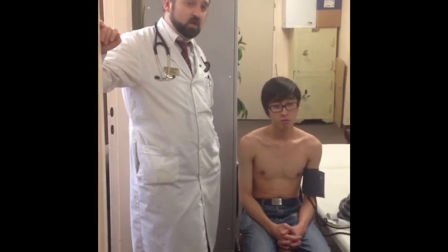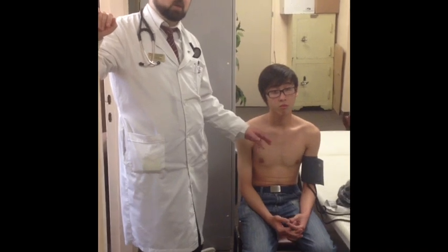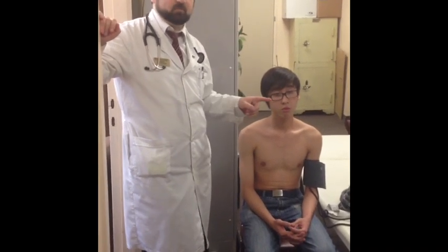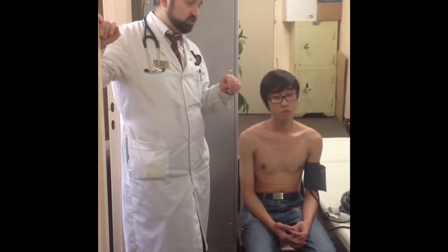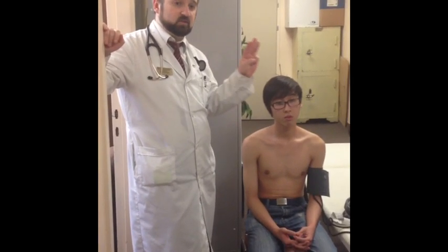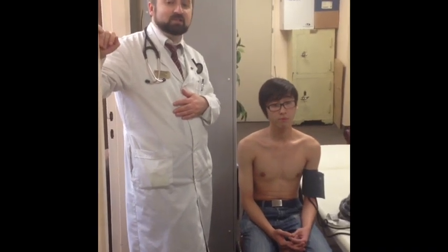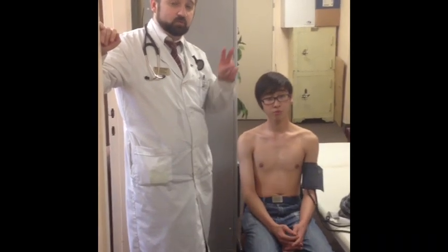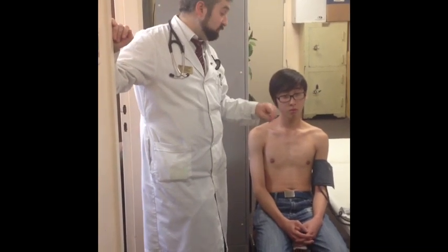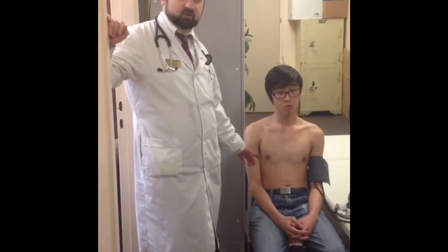Question: What should we do after we measure? After one measurement, we wait two to three minutes and measure a second time. In some international recommendations, three measurements are recommended. We then calculate the mean value of the two or three readings, and this mean value is considered the patient's pressure on that arm.